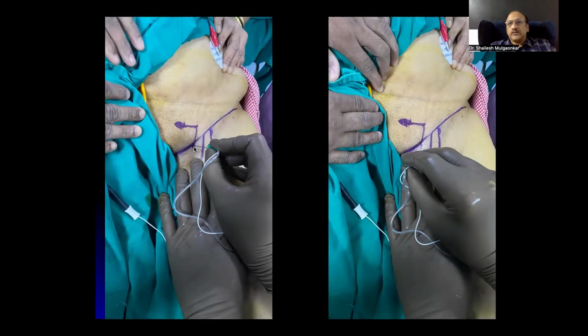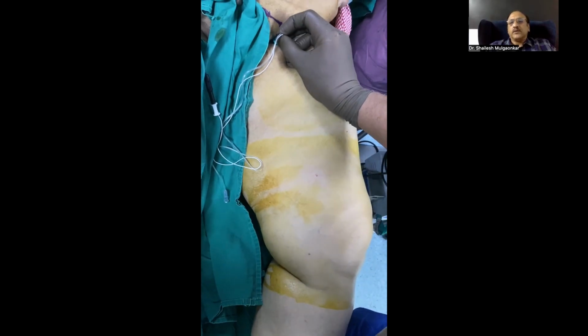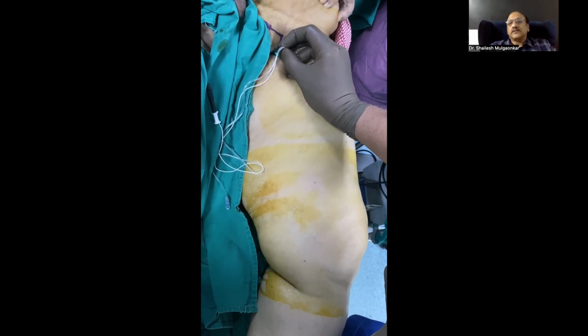Go first perpendicular to the skin. You might hit the inferior pubic ramus, and then just withdraw the needle slightly and go more laterally where it comes out from the superior pubic ramus. But don't go too deep because there are multiple vessels inside. I will come to that later on. So here I am giving the obturator nerve block, and the end motor response to be accepted is the adductor twitches.